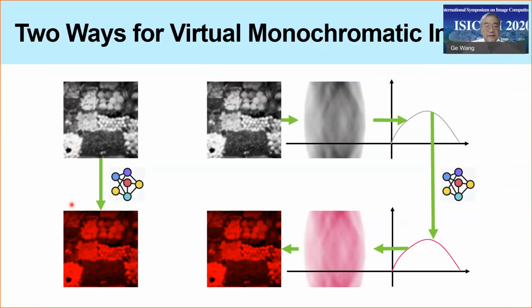On the other hand, with dual energy CT scanning, you could do virtual monochromatic imaging. So you have a gold standard, which is acquired with a more expensive dual energy CT scanner. So if you have a current integrating scan with a single X-ray spectrum dataset, you can reconstruct this image.